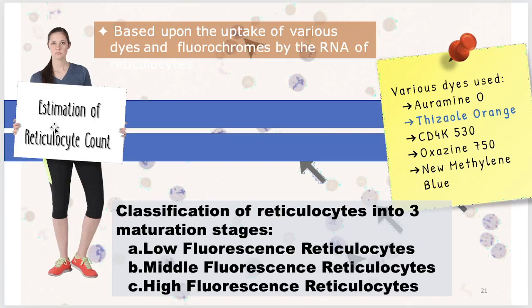And since your reticulocyte counts will provide a quantitative measure of erythropoiesis, remember, your reticulocyte count is a younger red blood cell. So therefore, the more erythropoiesis, because we need more RBC, the younger the cells that are also being produced. So mas marami tayong nakikitang reticulocyte count. Therefore, it will now give us a quantitative measure of your erythropoiesis.